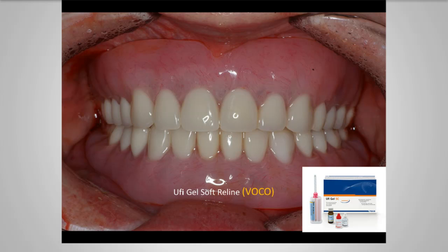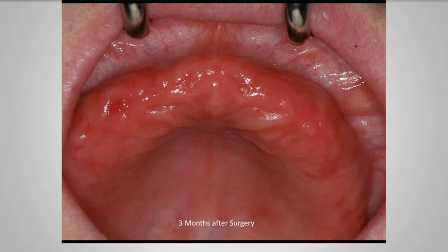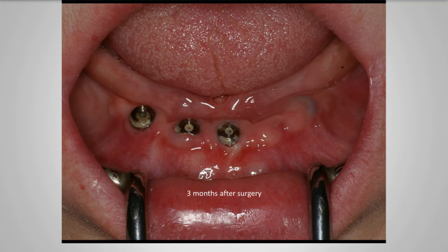If you use Vaseline and the Vaseline is not completely removed, then what can happen is the tissue areas that were cut may not heal together. So I prefer to use the KY jelly, which is water soluble.